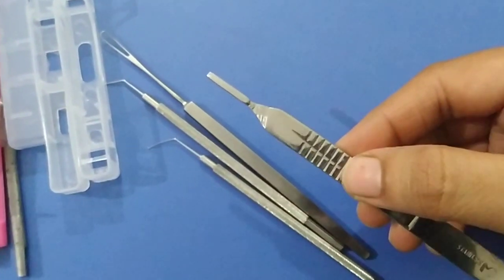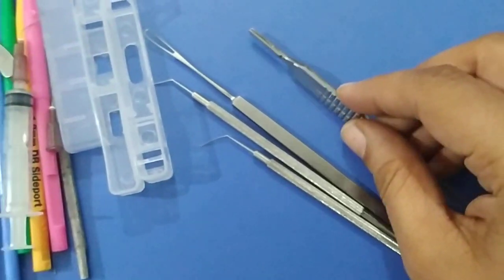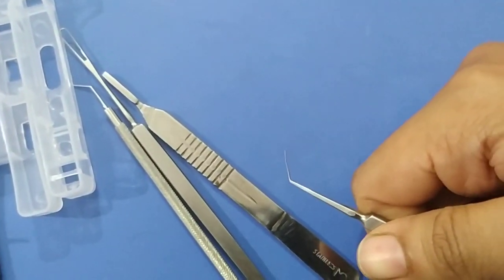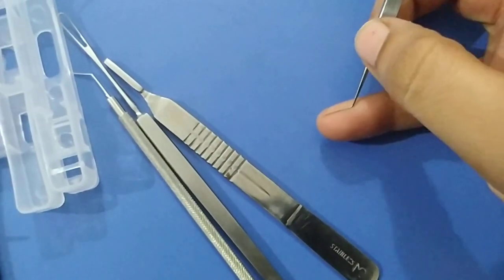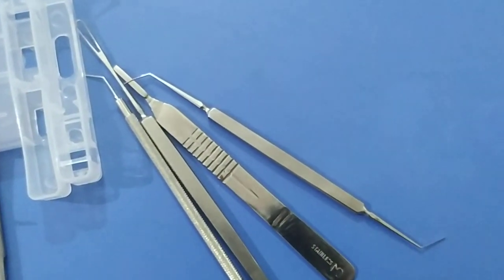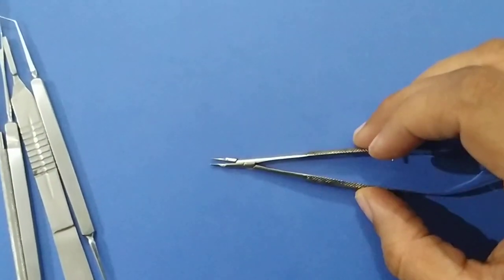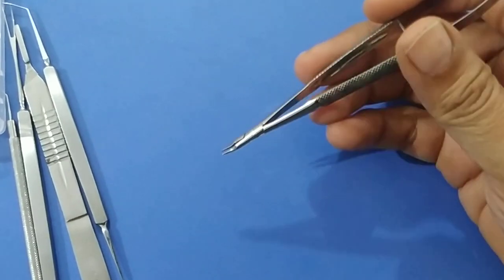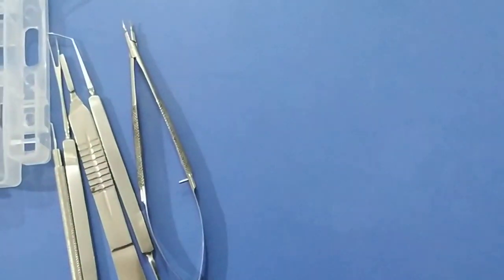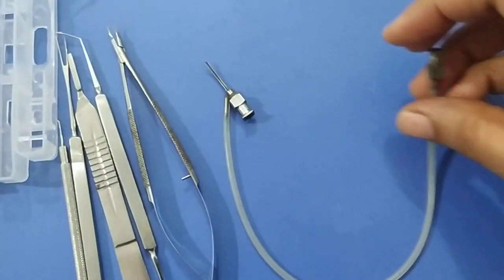This is a Bard-Parker knife holder. It is a stout instrument and various blades like number 15 or number 11 blades can be fitted onto it. This is our iris repositor — it has both sides, one angle, and is flat at the angle with no notch at the tip. The iris repositor is used to reposition the iris whenever there is iris prolapse during any type of cataract surgery or intraocular surgery. This is a Barraquer needle holder, used to hold a needle and for suturing in cataract surgery, pterygium surgery, squint surgery, and retinal detachment surgery.